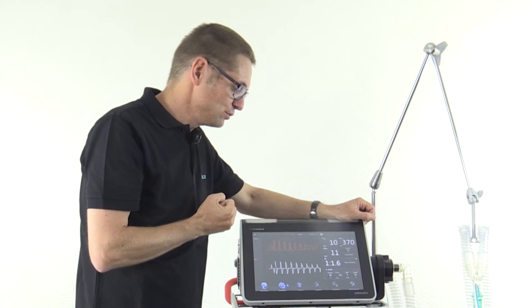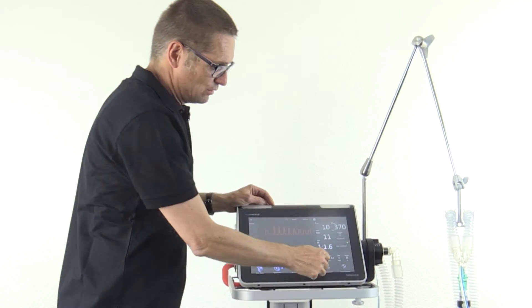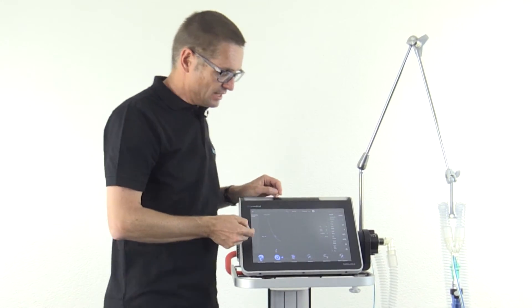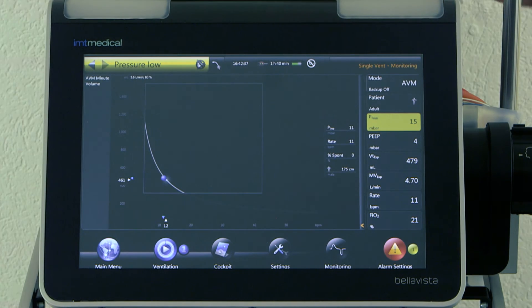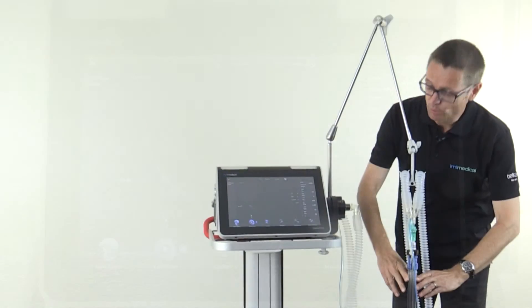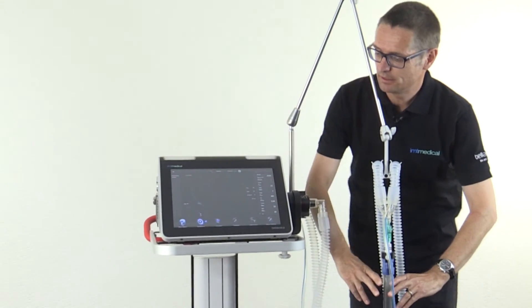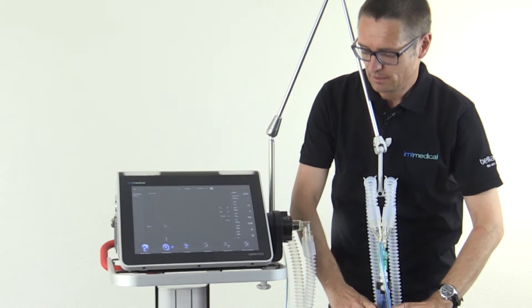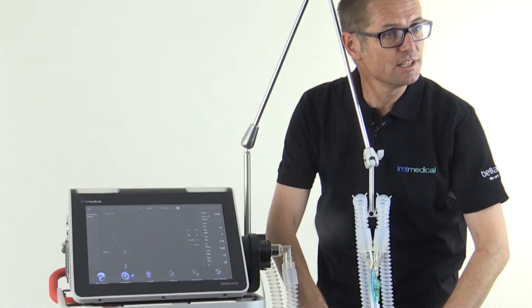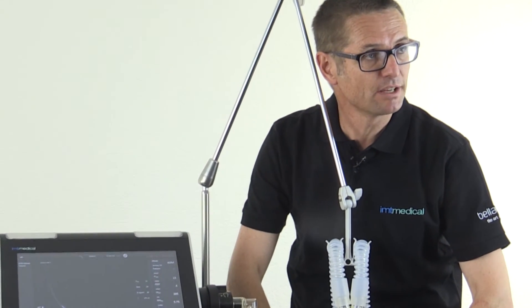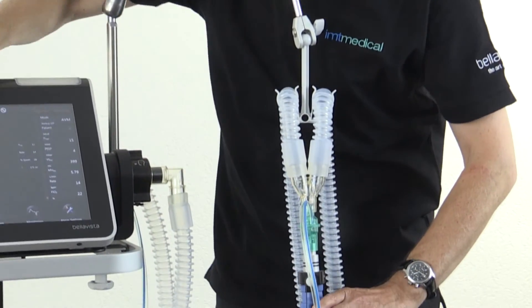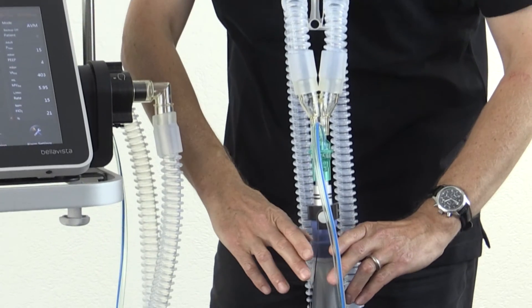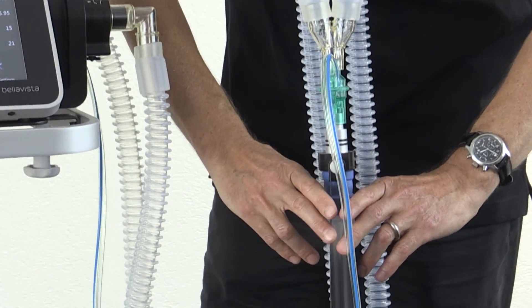The patient's CO2 will increase and he will have to breathe more. Looking at what happens now in the AVM graphic: the patient wants to start breathing spontaneously. He can add ventilation by increasing his frequency or by increasing his tidal volume, and that will add minute volume. So we can motivate him to start breathing spontaneously.